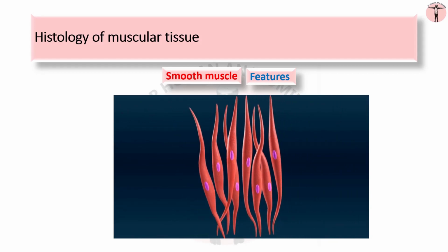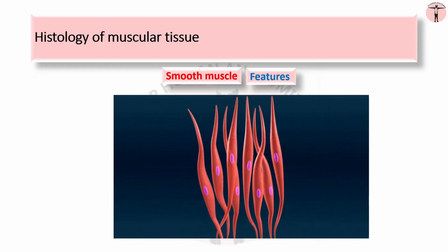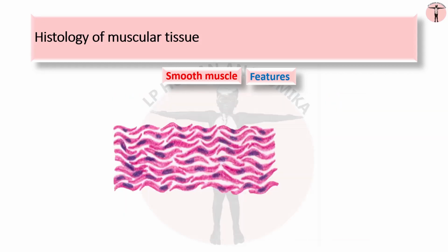Smooth muscle fibers are elongated, spindle-shaped with a single nucleus present in the bulged central region. The ends are tapered or narrowed. The fibers are arranged in fascicles. Smooth muscle is specialized for slow, steady contraction and is controlled by a variety of involuntary mechanisms. Fibers of smooth muscle are also called visceral muscle.